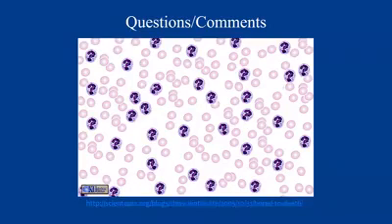And when I'm bored and having a day where I need to entertain myself, I just imagine myself as a detective, and I'm looking at the blood film and really trying to figure out what's going on. And there's nothing more exciting than calling a clinician and saying, hey, I have a diagnosis based on the blood film, and that's all we needed to do. So there's a lot of power in this diagnostic.